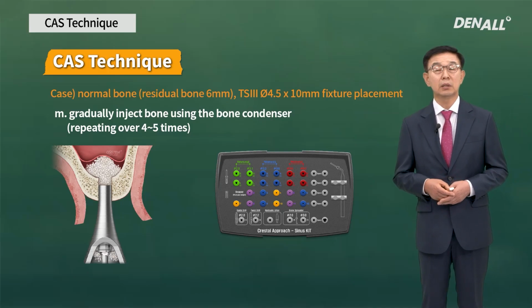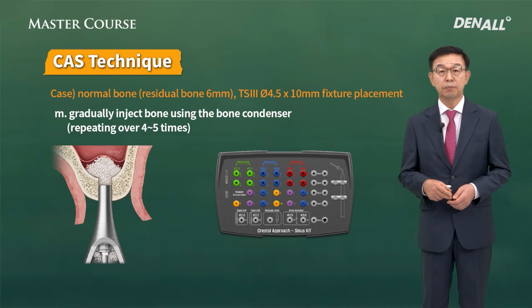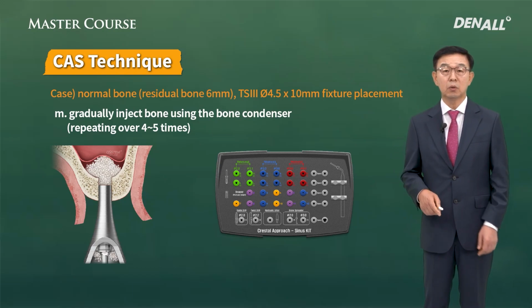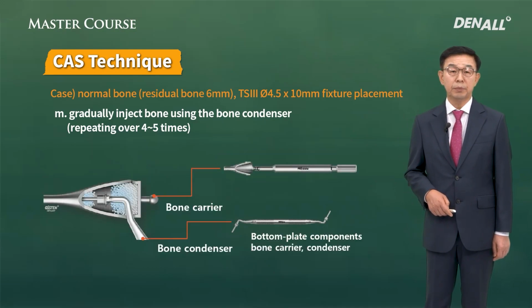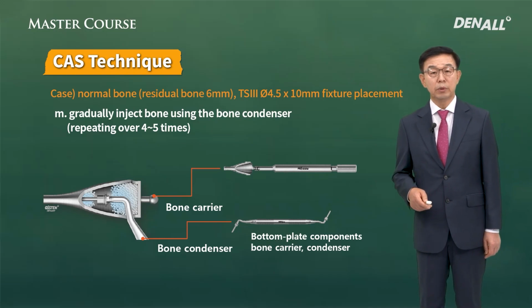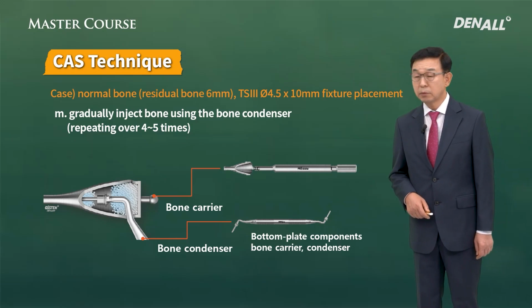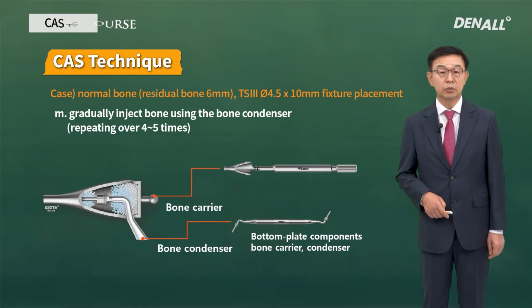Finally, always pull to remove the saline in the sinus. You need to do it fully. Bone graft should be done and the implant should be placed. In doing bone graft, there are tools for bone graft. There's also syringe-type bone, and using that you can do it quite simply.